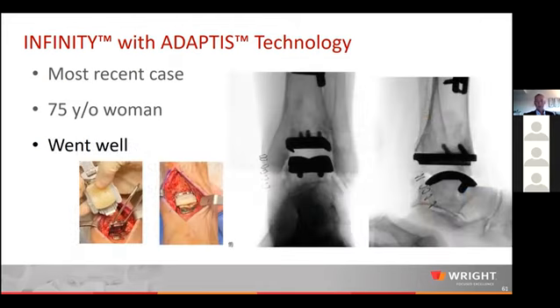It went very well. There you'll see us post-operatively. Again, this has just been 1 week, but you can see my graft material up in the distal tibia and also cement around the distal peg, particularly on that medial side where the major cyst was located.